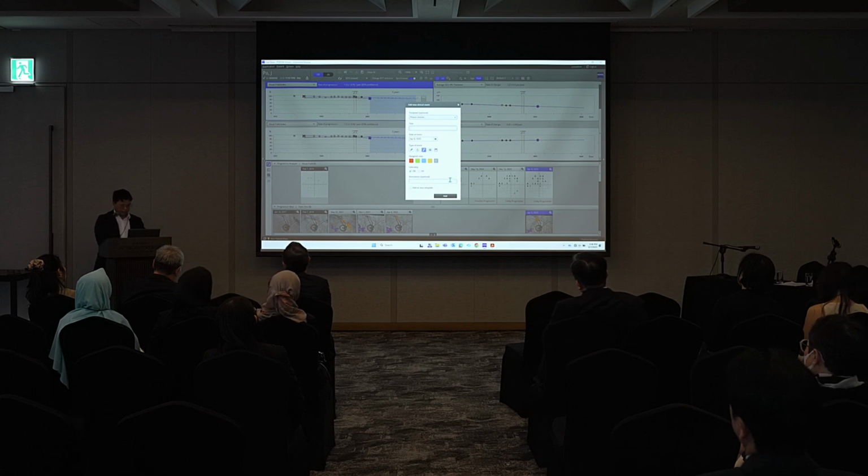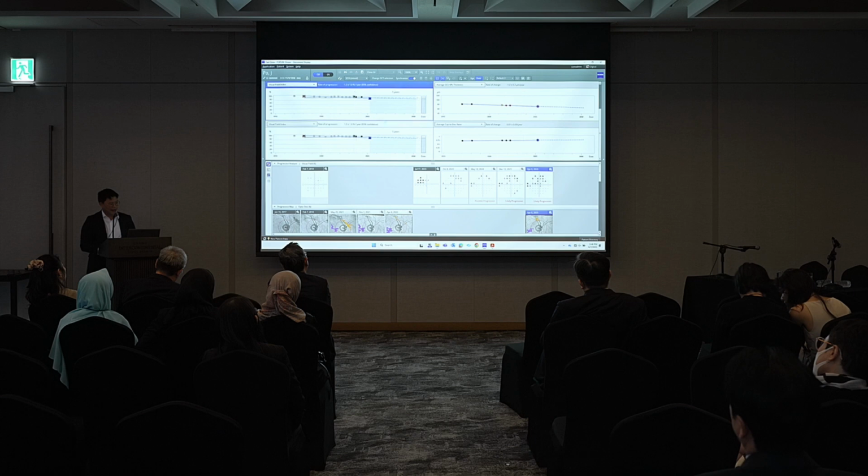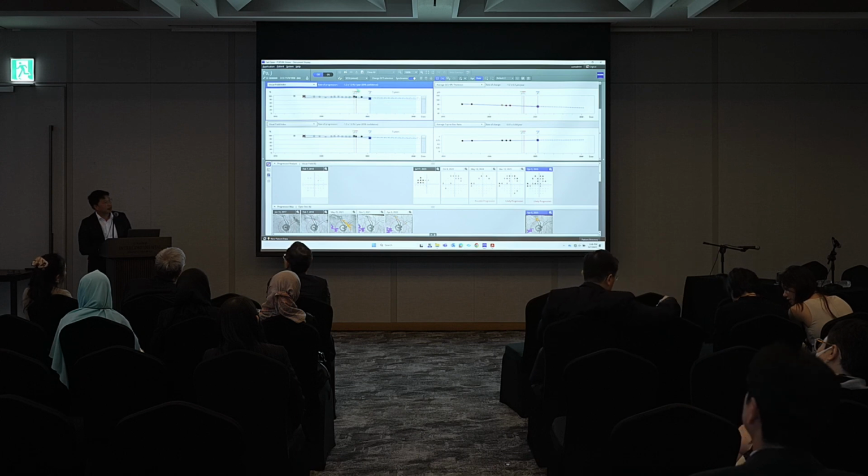But here we can just say the patient's had right Paul tube surgery, because we know it's the right eye. We can assign a color, select on laterality and add that. And basically going forwards, if you mouse over it, exactly as you said, it's quite nice to present in conferences and all that. It's quite powerful to have all this together in terms of the patient's journey with us.